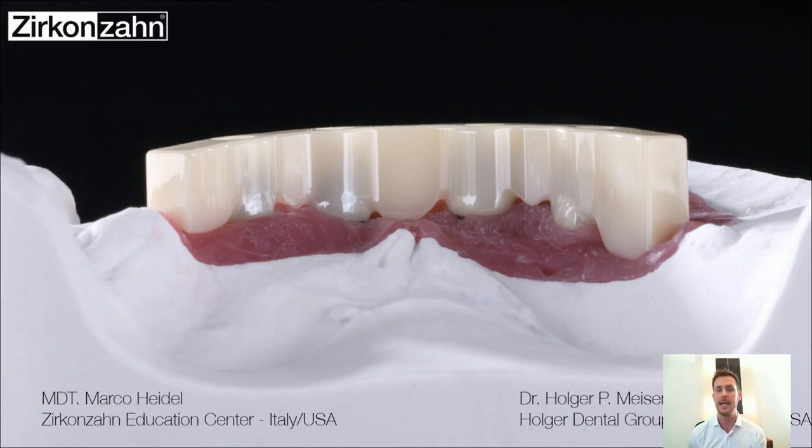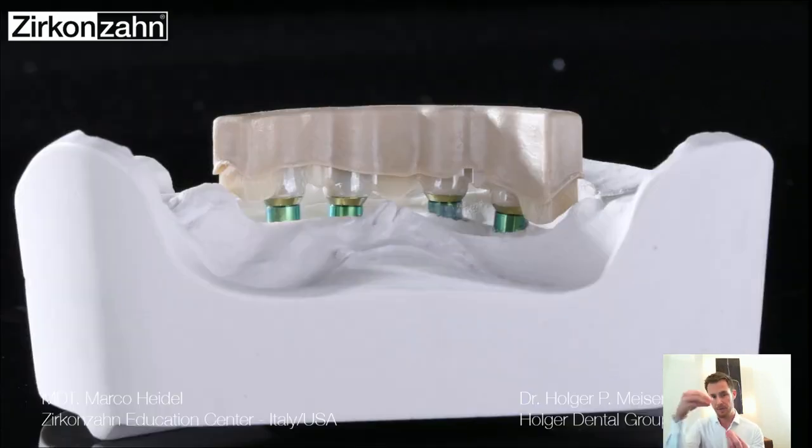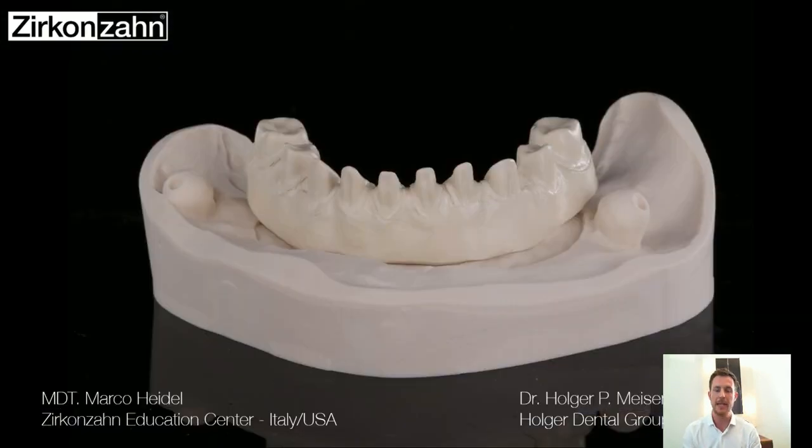The friction retained works like this: you have to create a bar very parallel around, and in this case I used zirconia to mill it out, and onto it, to get the friction, I designed and milled a friction sleeve in Technomate. This is a really flexible soft PEEK material, and onto that now comes the structure milled in another PEEK material called Technomate Mineral.